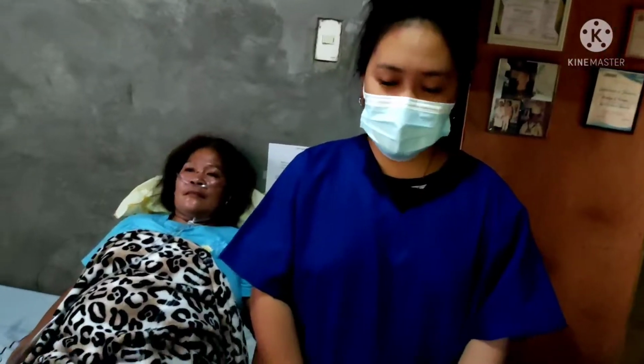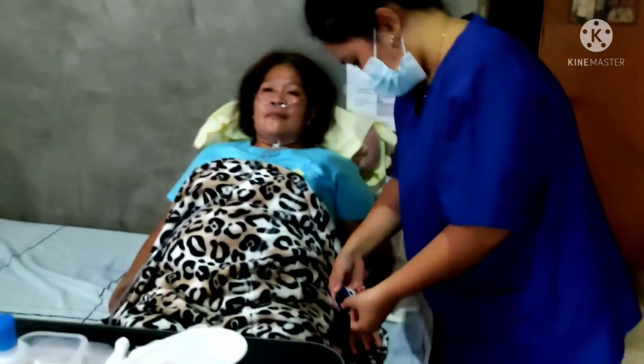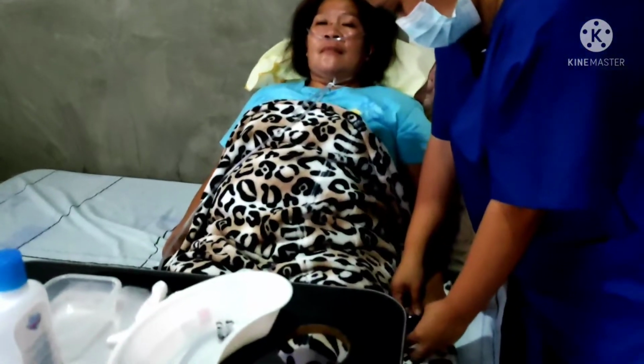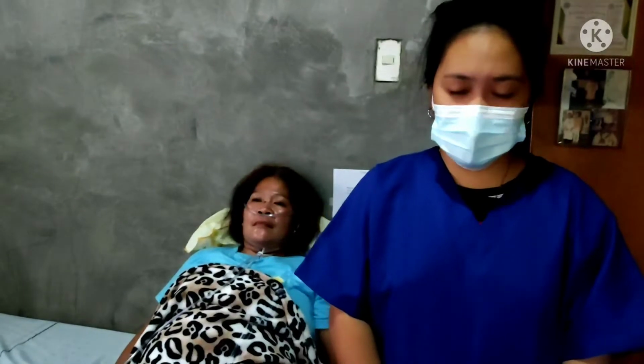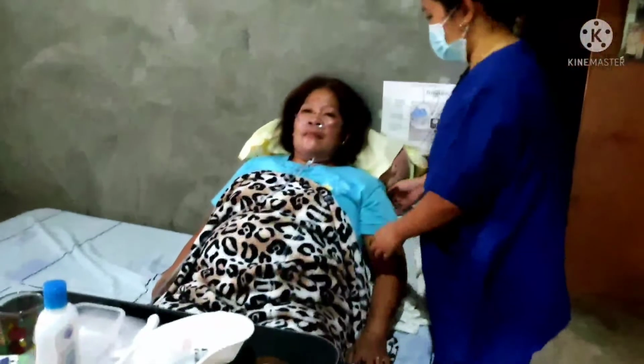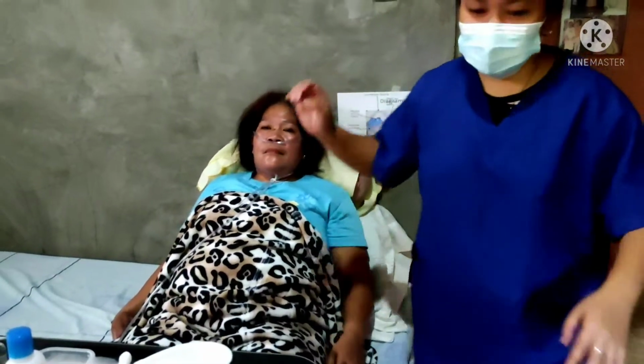Okay lang. Apply a pulse oximeter to monitor his or her oxygen saturation level. Help the patient into semi-Fowler position or sitting position.